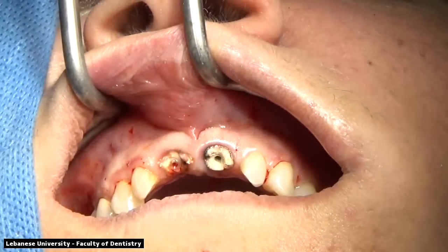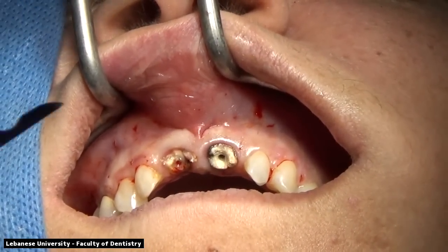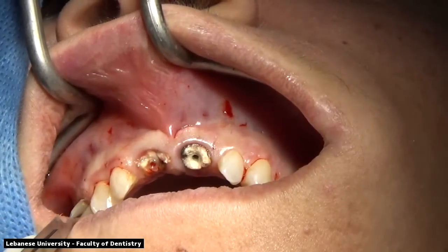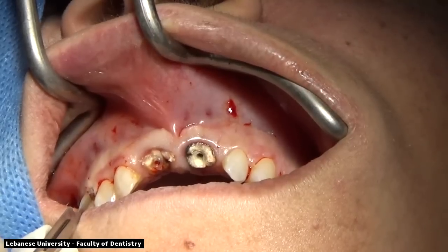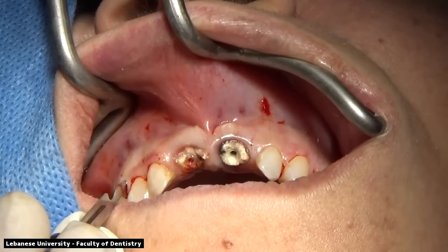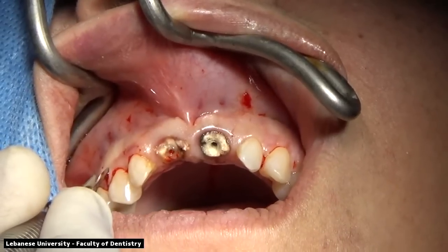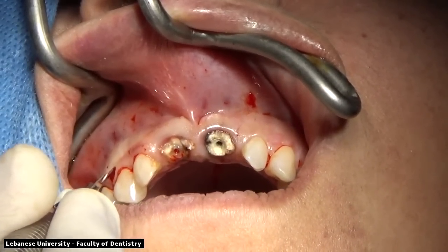We will be using a 15C blade to start with the gingivectomy. As we see, we have some bleeding points which will indicate the level where we're going to be doing our gingivectomy procedure. We're going all the way to those points, which are the bleeding points from the cementoenamel junction to the bone.